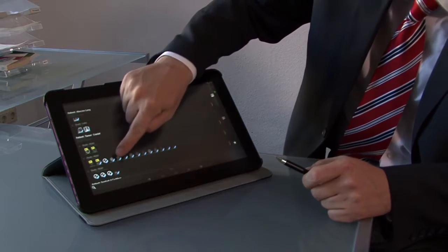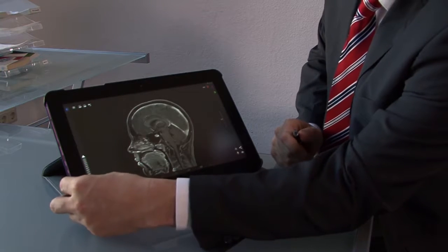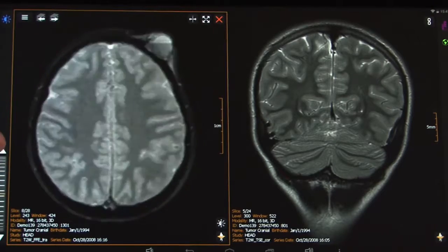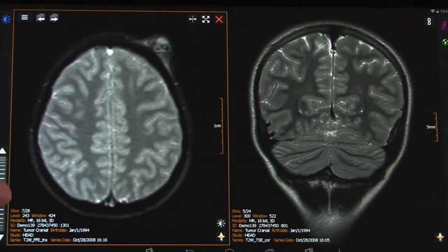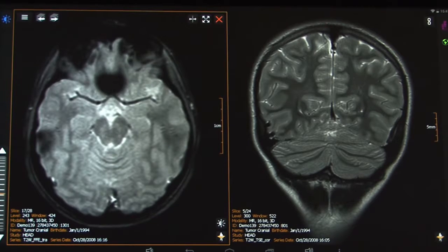There should be a so-called minimum pixel size, so pixels should have a minimum size in order to have a good angle for our human eye to see it. The grayscale calibration should deviate maximum 10% to the proper linear curve. So our MedTab reaches plus minus 5%, while consumer displays usually exceed that curve by more than 50%.